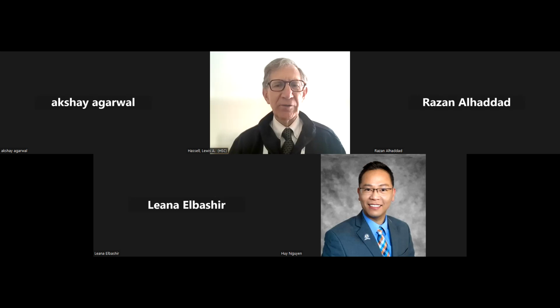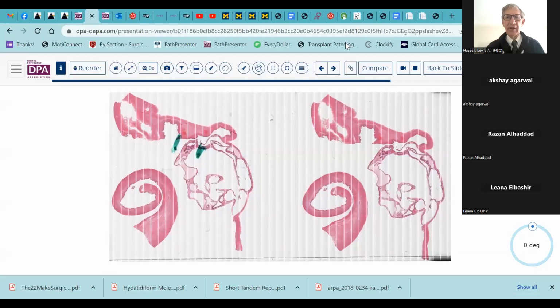So I'm going to switch to a different screen here and go to the slides. So you should be able to see the slides now, and I apologize that the scan here is less than optimal.